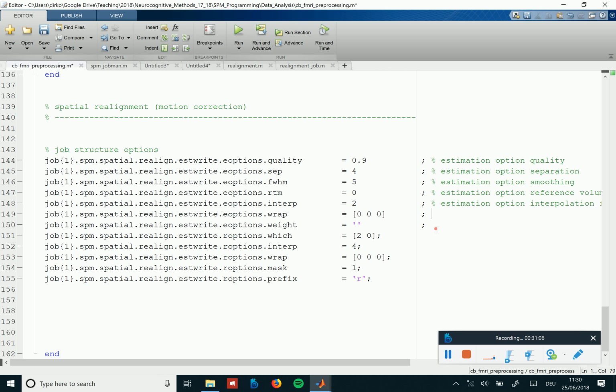The main reason for that is that people are not interested in the literature that much, because it would be very mathematical, and people don't want to do the math, but want to realign the data. So I want to realign the fMRI data myself, but I don't want to go into the math. So I use this software, and then nobody knows again what's going on. Ideally, in an ideal world, for all the SPM functions there would be a nice literature that explains what's going on. To some degree, we are trying to actually do that, but I always tell myself I don't want to do this anymore, because why am I doing it?